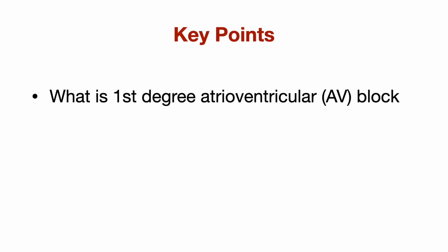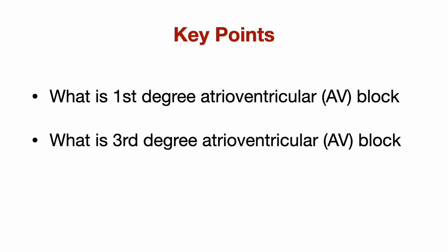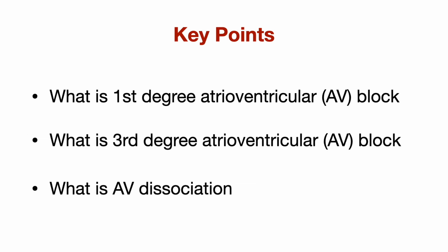This is part one of a three-part series on atrioventricular block, where you will learn the following. 1. What is first-degree atrioventricular block? 2. What is third-degree atrioventricular block? And 3. What is AV dissociation?